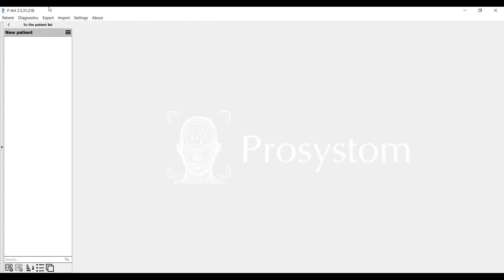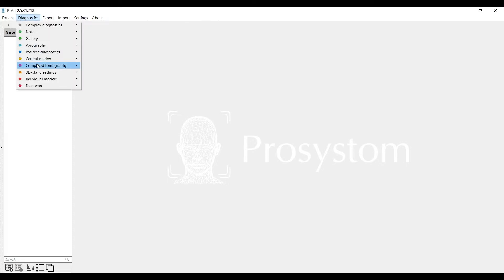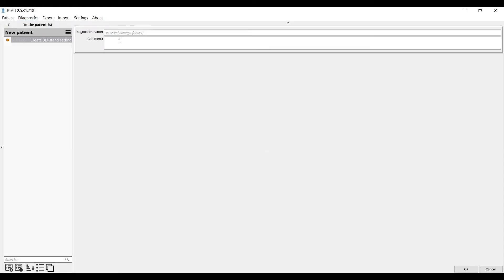First in top menu, Diagnostics, we choose 3D Stand Settings. For easier work in the future we name it as Mounting.